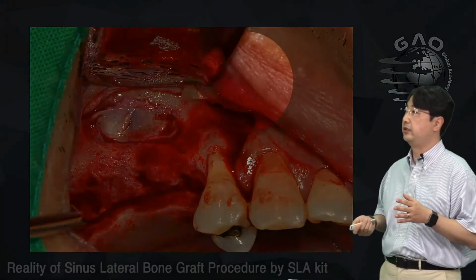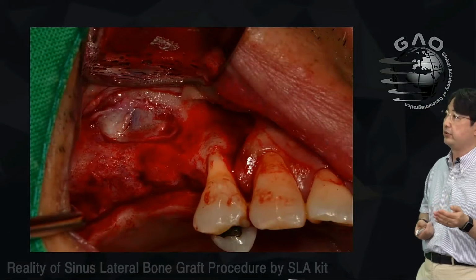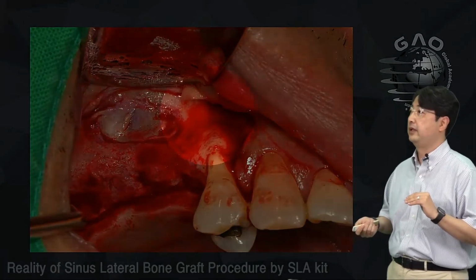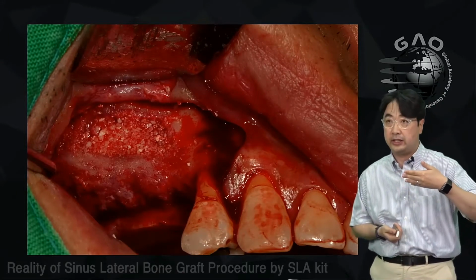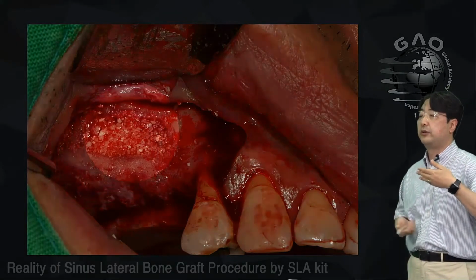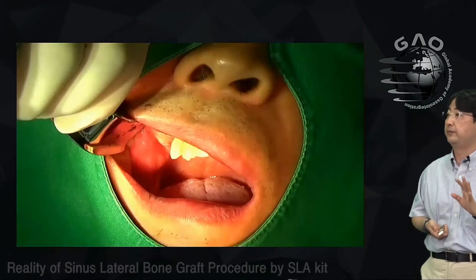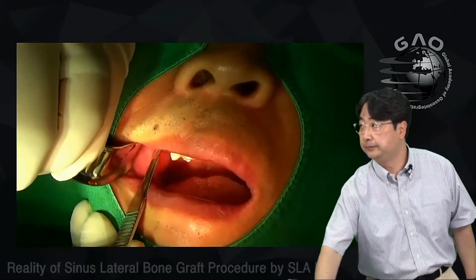This is a clinical picture after I dissected the periosteum. And you see the periosteum and maxillary sinus membrane are sticking together, okay? Like this. And this is a clinical picture after I dissected the sinus membrane and did the bone graft, right? After that, I covered the anterior lateral opening with a PRF membrane. So let's see another movie.